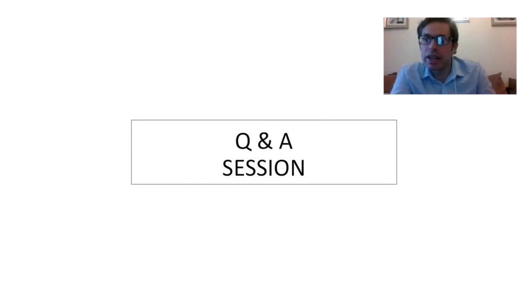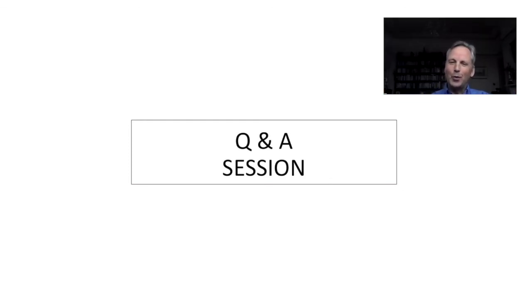We've got a question asking about balloon sinuplasty, just saying, how long do you keep the balloon up for when you're doing your sinuplasty? I thought a better question might have been, when do you use a balloon sinuplasty? And that's one I can't really answer too well. Keep it up for a minute and then let it down. Usually it requires three passes. I think it'd be a very good procedure for a person who gets repeated barotrauma of the frontal sinus. I think one of the big issues for the NHS is its cost. And to mitigate the cost, putting that into an outpatient local anaesthetic setting is probably the future.